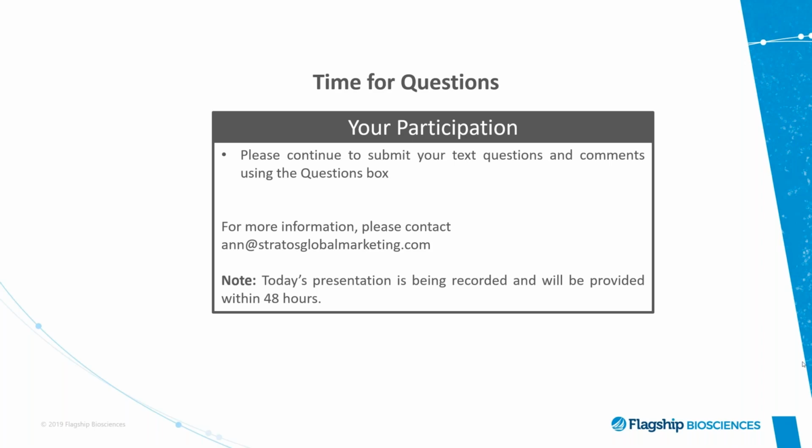At this point in time, the mainstay of this approach is the comparison with the pathologist evaluation. So, at least for the time being, the pathologist is still the gold standard under which the validation approach is executed.